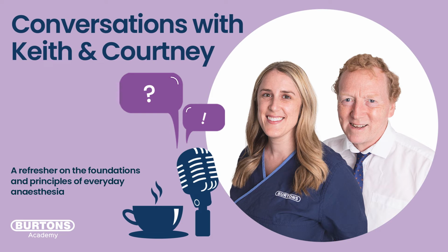Then as the animal keeps breathing in fresh air, that remains at 0 over the course of time, and then there comes a point where the animal starts to breathe out. And then we don't see a rise at that point. What we basically see is all that fresh gas that's sat in the dead space of the animal, in the trachea, the bronchioles, starts to move back up in the other direction, picked up by the capnograph as 0% CO2 because it's fresh gas.